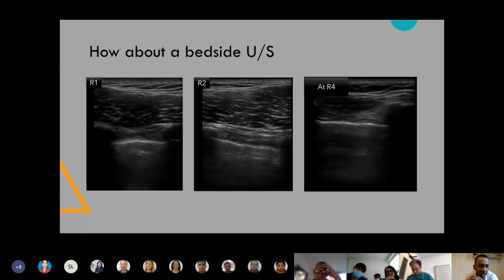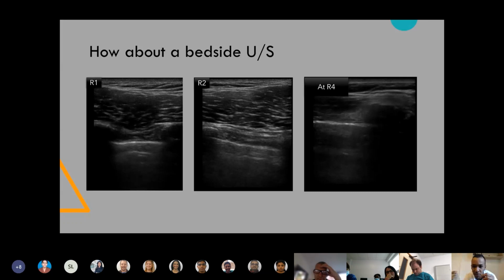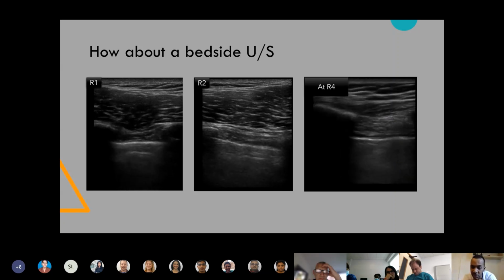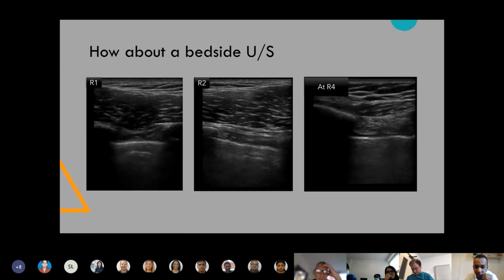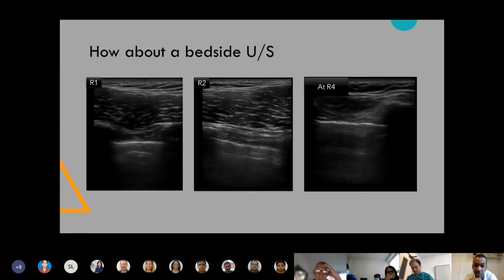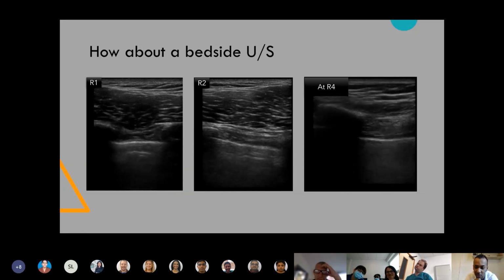We only used to have FAST, and not many people, only our ultrasound director used to teach us the eFAST, the lung ultrasound, the DVTs and all that. But the consultant on shift that time was not a POCUS practitioner. However, he did take my word for it that this is abnormal, and we ordered a CT scan. This was the first time that I saw a lung point live, me diagnosing it. I've seen it in videos and teaching, but never diagnosed it.